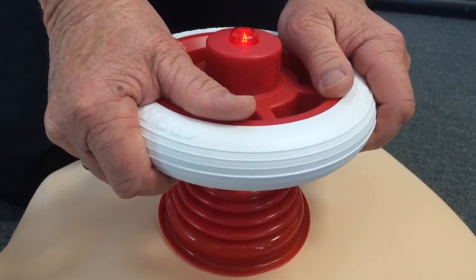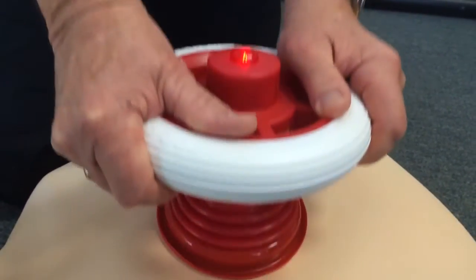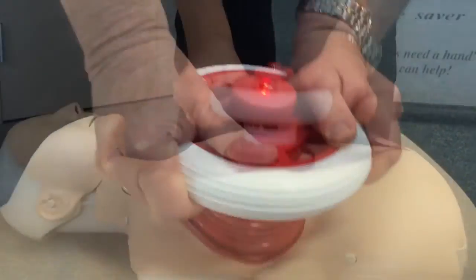Push hard, push fast. Push, push, push, push, push, push, push, push, push.